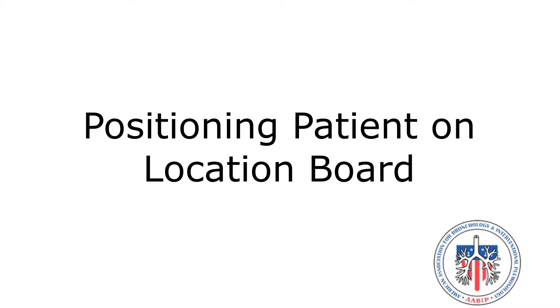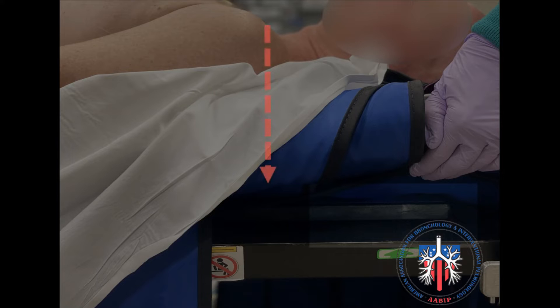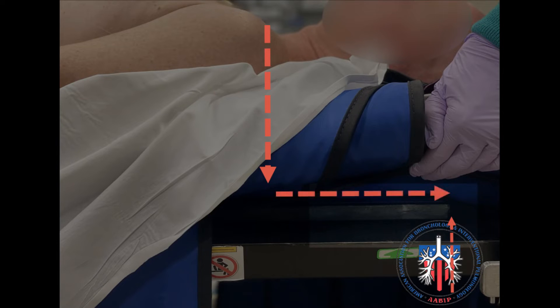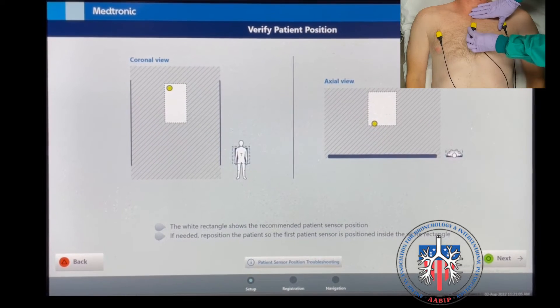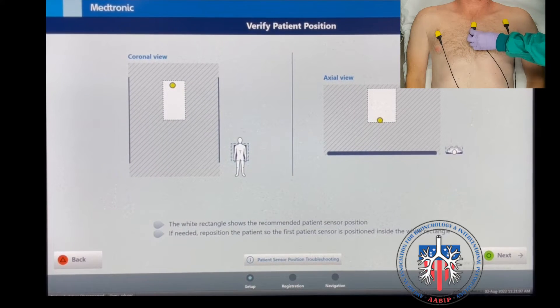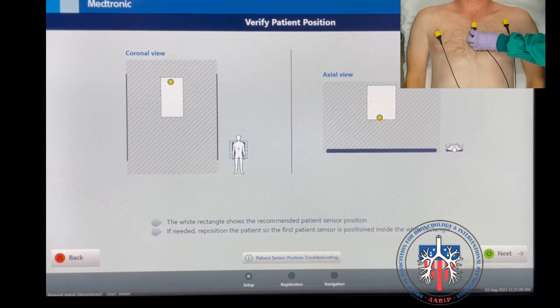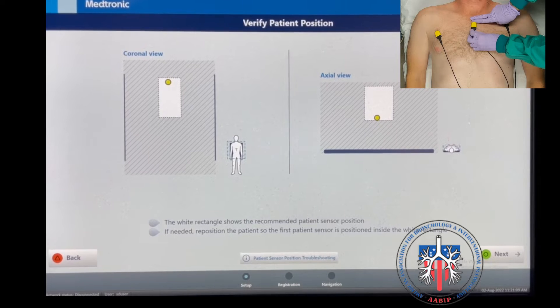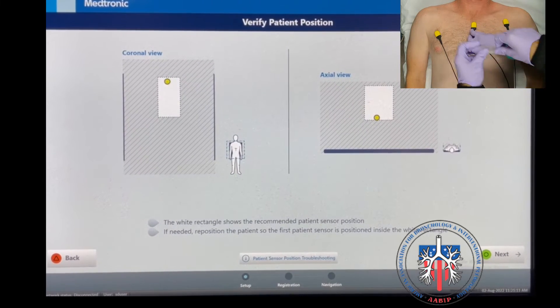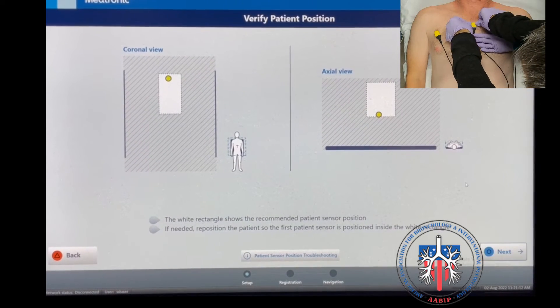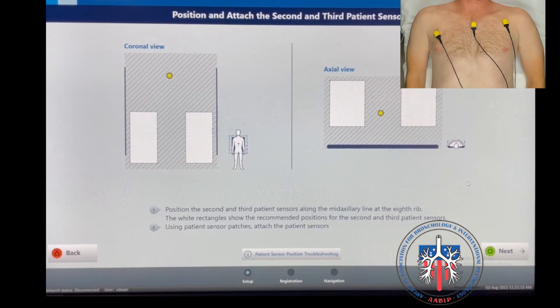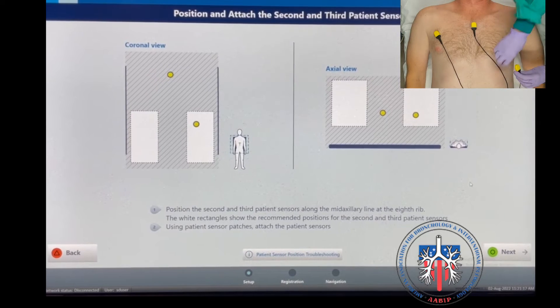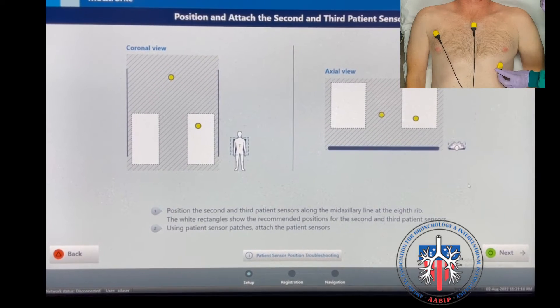Positioning the patient on the location board: the shoulders should be at or below the top of the location board. The sensors are placed on the chest as follows. The sternal sensor is placed two finger-breadths below the sternal notch; the yellow dot should be within the white box as shown. In this example, tape is used to secure the sensors. The screen is advanced and the left-sided sensor is placed on the chest so the yellow dot is in the white box. This is repeated for the right side.